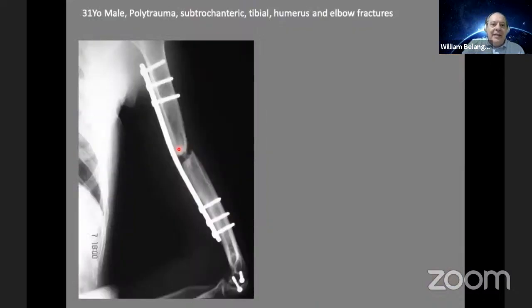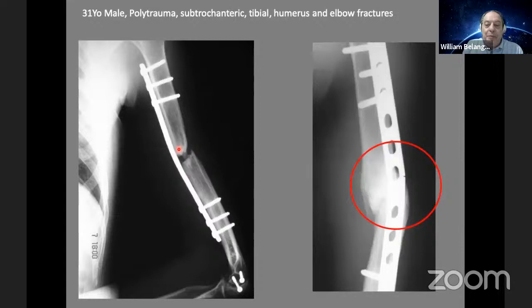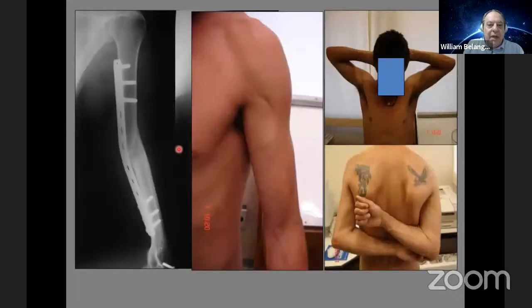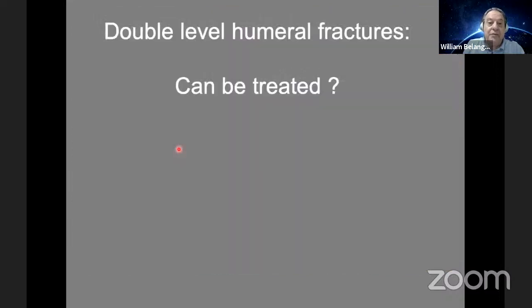This is another case. In this case, it's a polytrauma patient with several other fractures, and we didn't get bone contact. The plate broke, but the fracture heals. Okay, sometimes a surgeon must be lucky. This is the final result of the case, but in the majority of cases, we can have this good result. Then be careful with transverse fracture. Bone contact is the key to have a very good result.